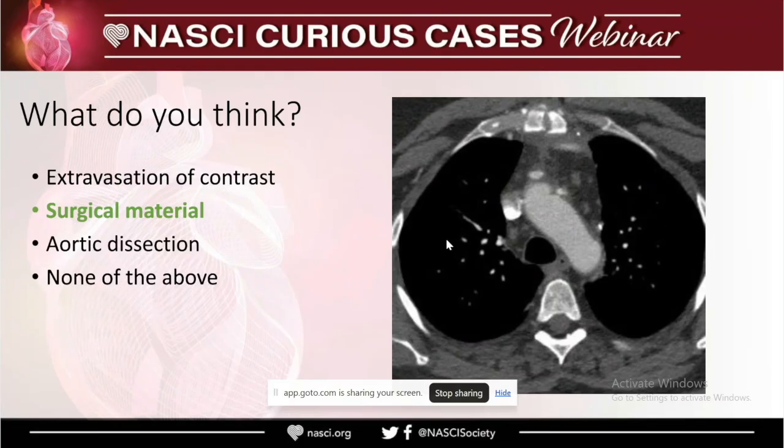It's a big drama because a patient after coronary bypass, why is it such a problem? Because at these locations, they sometimes connect the bypass to the machine, so they can actually operate on the heart. So this is quite concerning.